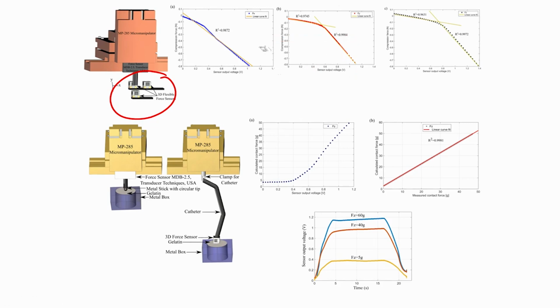So this is a very important experiment that you need to perform whenever you fabricate any sensor. You have to take a commercial sensor and perform the calibration part, okay. This is called calibration.